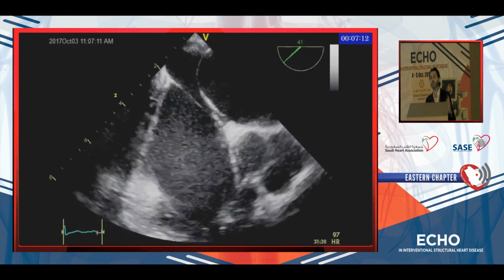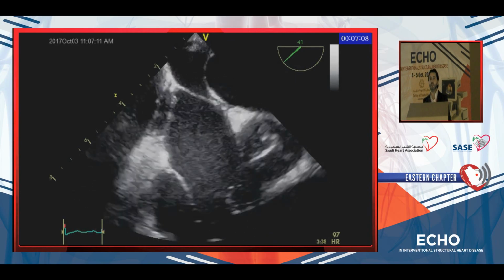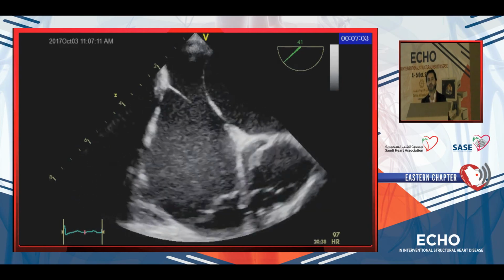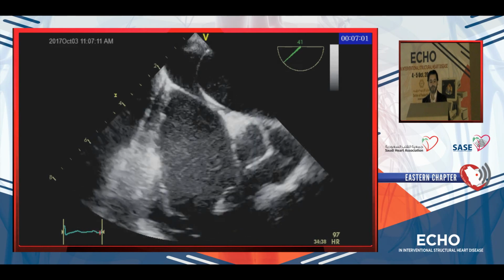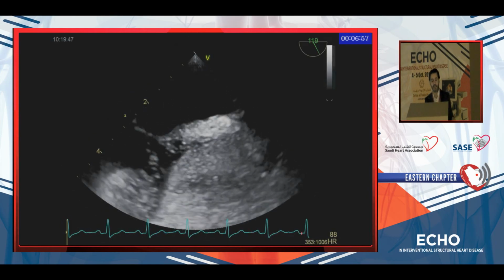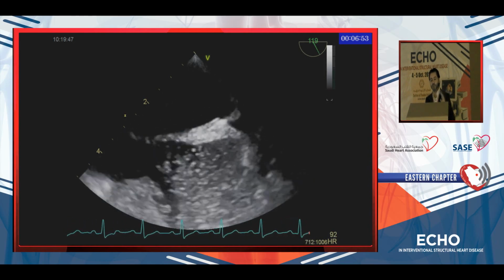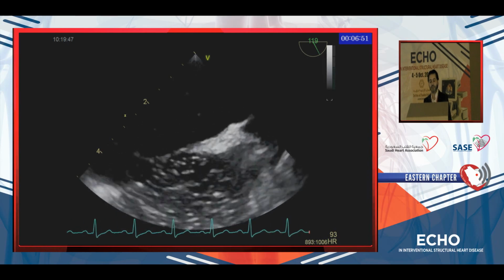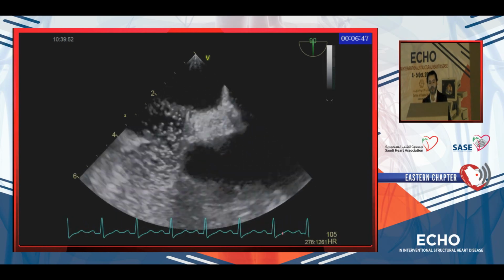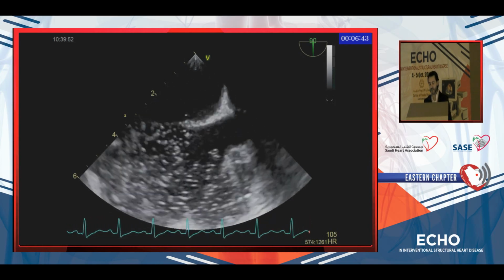Again, sometimes, if you have a Eustachian valve and you're really worried, it will prevent the bubble from being in contact with the fossa ovalis and from performing a good study for PFO. So you might like to do something else. As we can see here, most of the IVC bubble-free blood will be in contact with the fossa ovalis. So what we did here is we injected bubble in the lower limb, and here you go. It is significantly positive for a PFO.